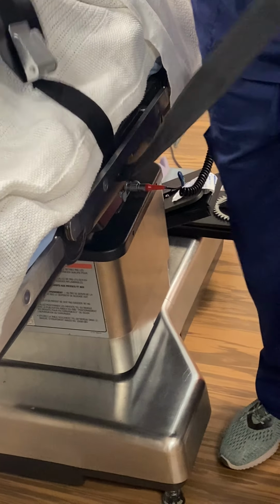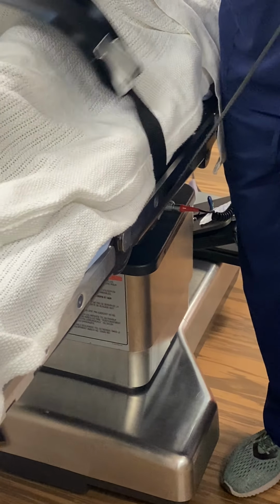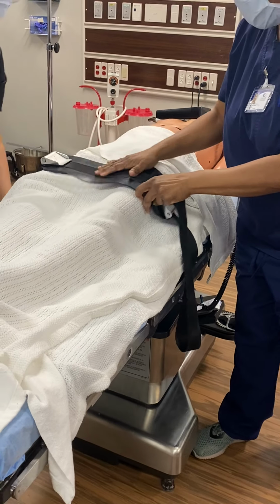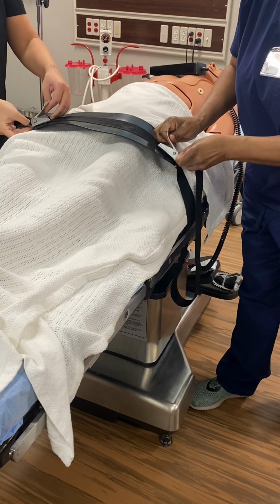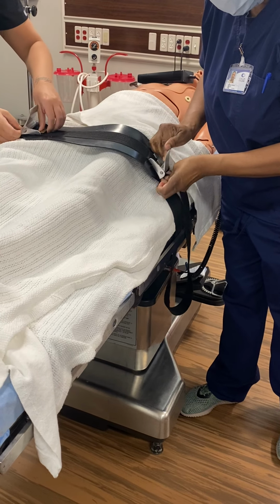So this is how we do this, right? And it should always be on the other side. I'm just going to put the arm on the other side. I'm not going to pull their arm out, and then put it like you're putting the seatbelt on, because anesthesia needs to get to this IV that's over here.